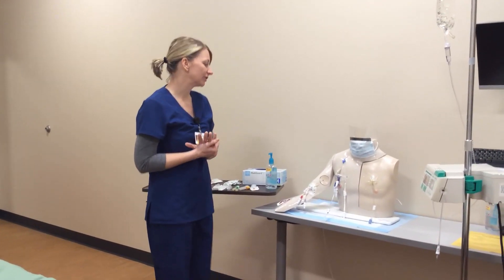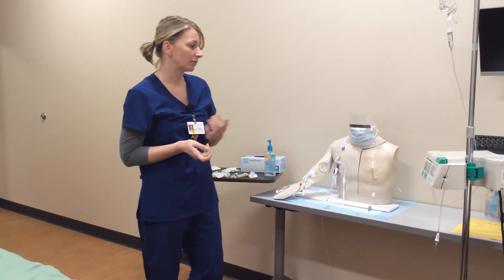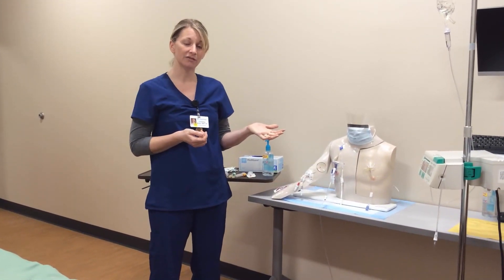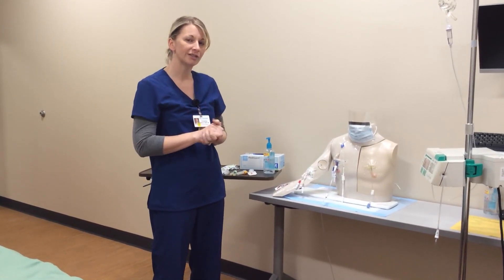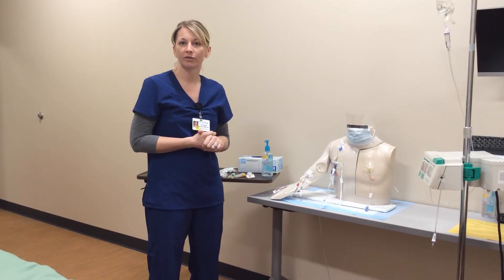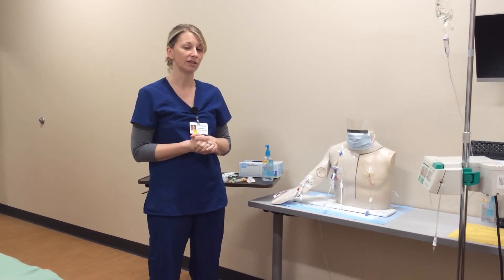Hi everybody, this is Christine. I'm going to demonstrate how to draw blood from a central line. I'll first do it when you have an IV that's infusing, and then right afterwards in the same video I'll show how to draw from a different person that does not have IV fluids infusing in their line.